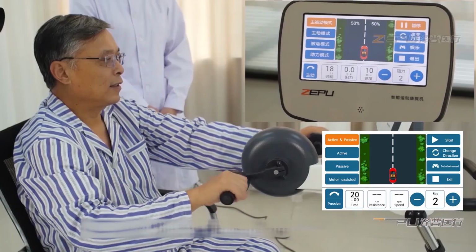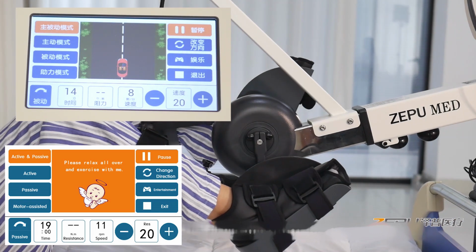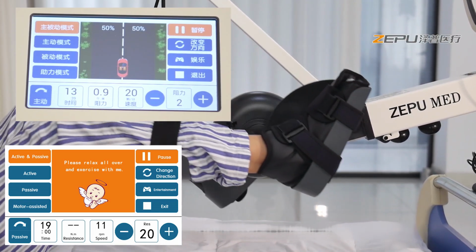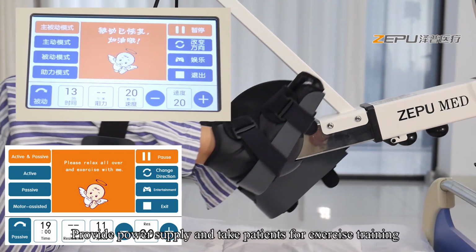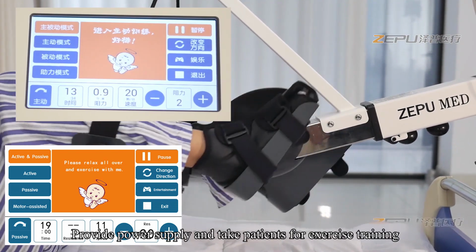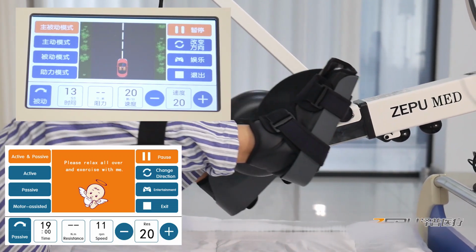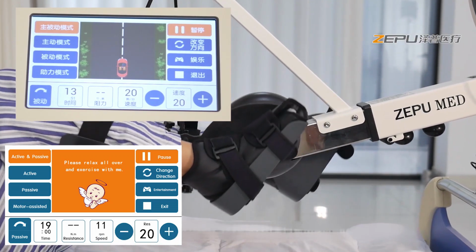4. Active passive trainer mode. This mode is an automatic switching mode between active and passive. Resistance training when the patient has strength. The machine automatically catches the patient's weakness when the patient has no strength, and provides power supply and takes patients for exercise training.